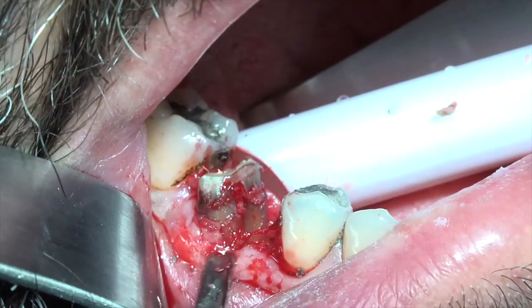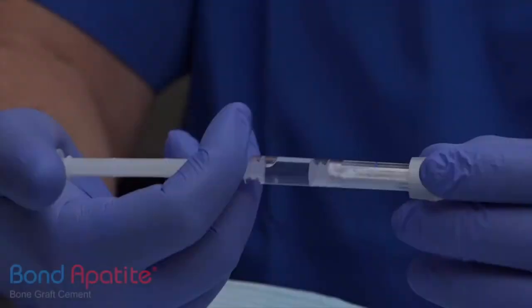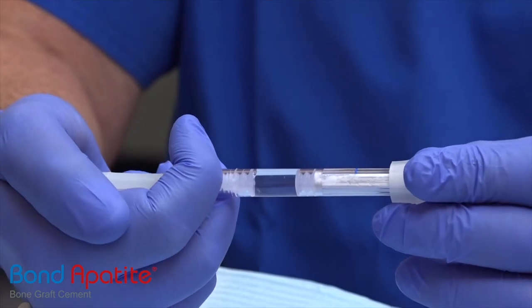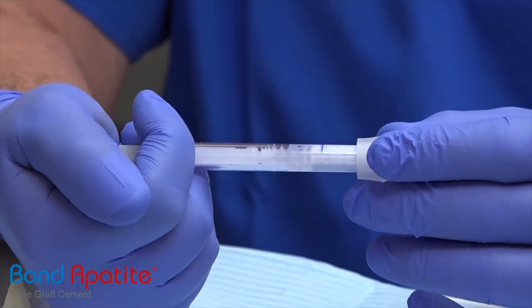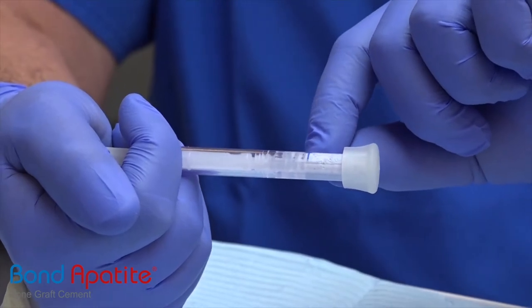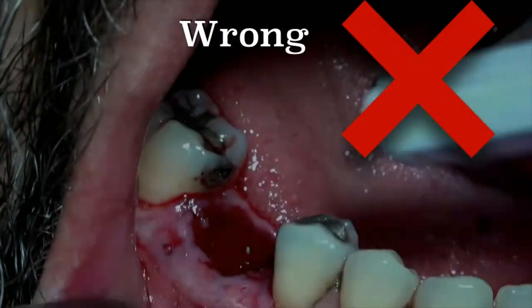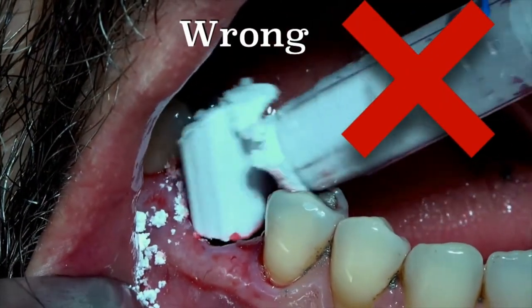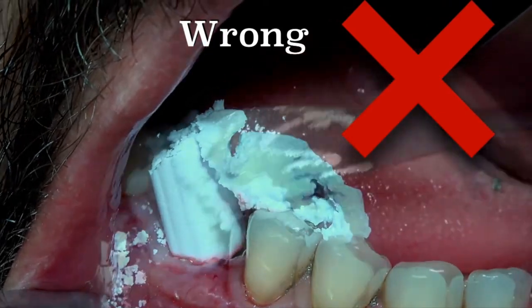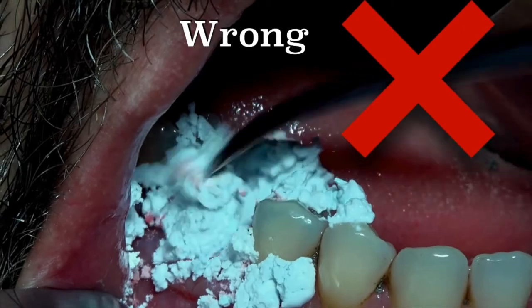Here we can see the extraction. After the extraction, the material cannot be used in increments like we do with granules. Suppose that you activate the cement in the syringe properly; however, you cannot eject the material in increments or play with it like you work with granules, because as you can see it's a mess and definitely it will never set.